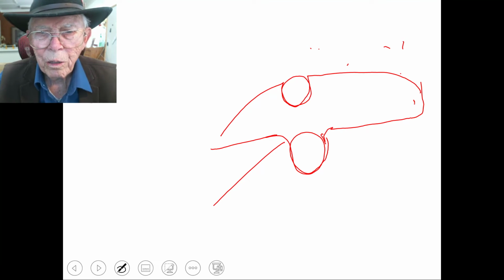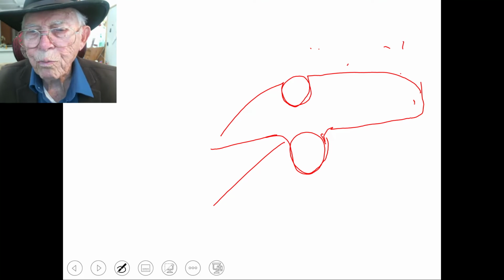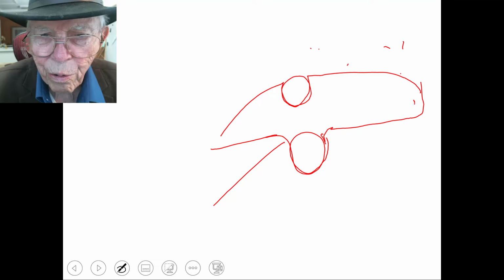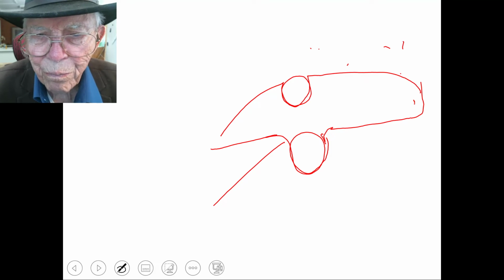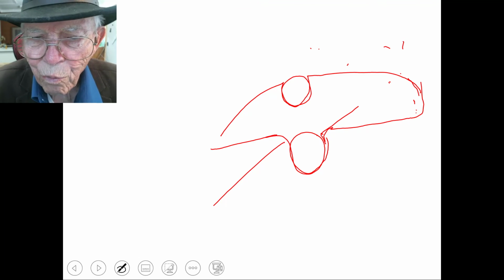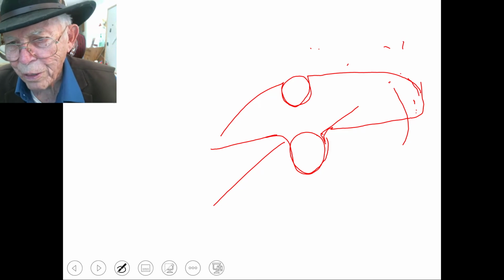Now, this would actually work for a lower arch, and you turn those things up. You've got to activate it. You tighten it, you tighten this up, and then it works for you as it pulls it down again.